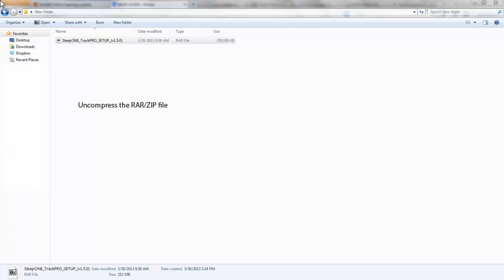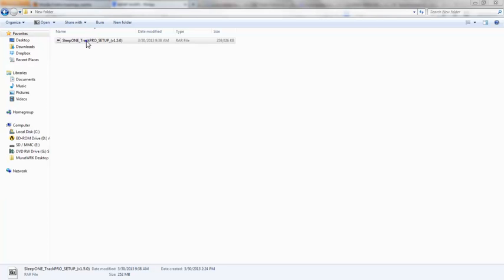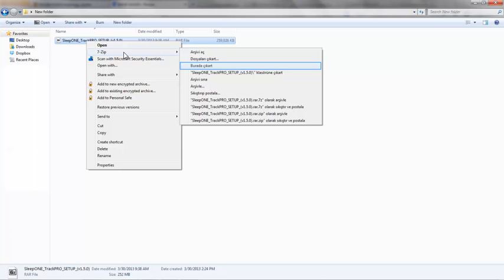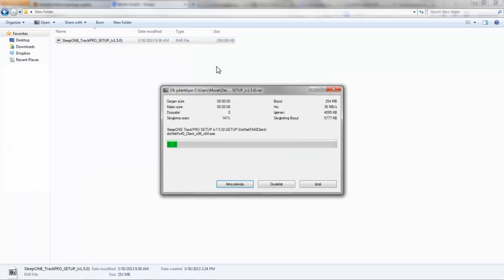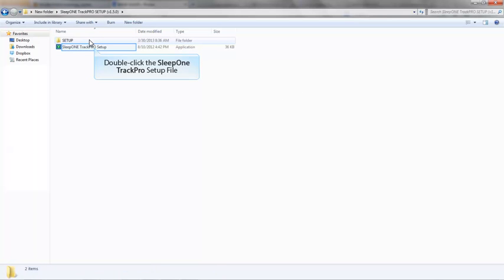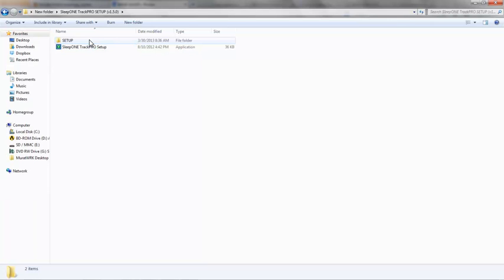Now let's start with uncompressing the archive. Now open the extracted folder. Double-click on Sleep One Track Pro Setup Application. It will install the necessary files for you.